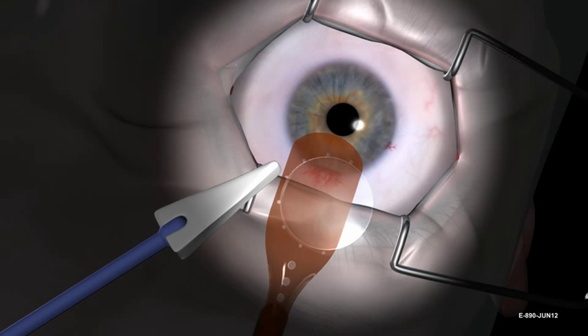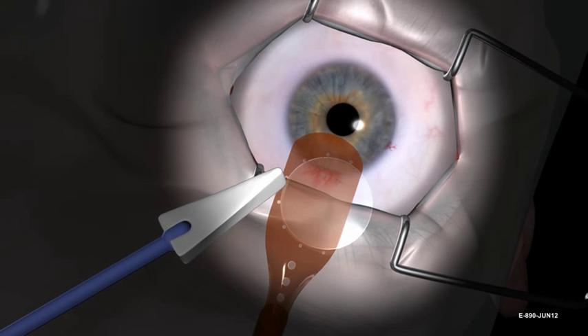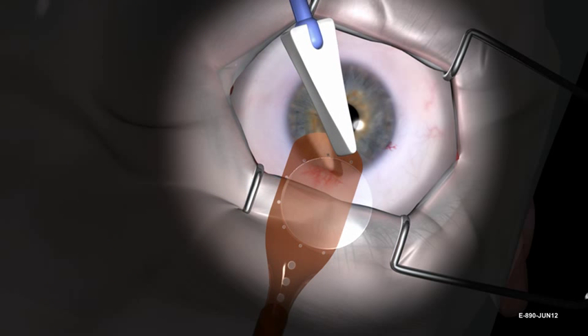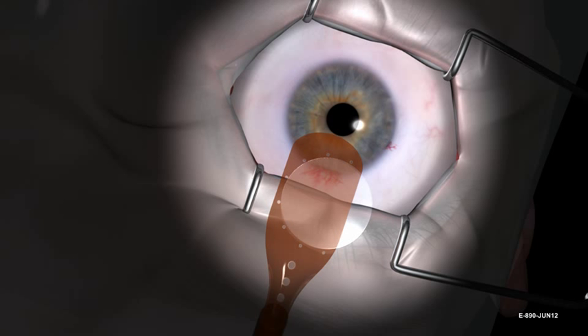Once tissue is properly positioned on the carrier, remove excess moisture from around the allograft with an absorbent sponge to enhance adherence of the allograft to the carrier during loading and deployment. Apply a small amount of cohesive viscoelastic to the endothelium.